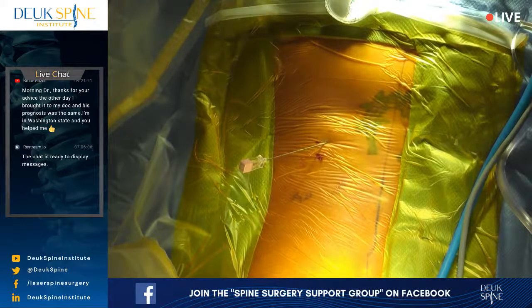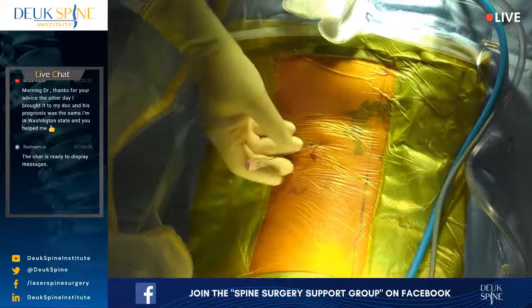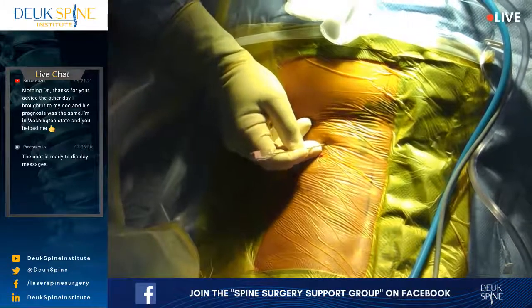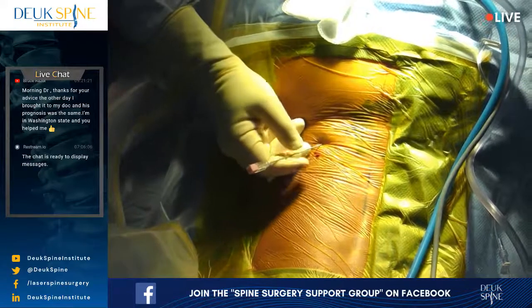Let's kill this light up here. Her L5-S1 is not that collapsed on the MRI.